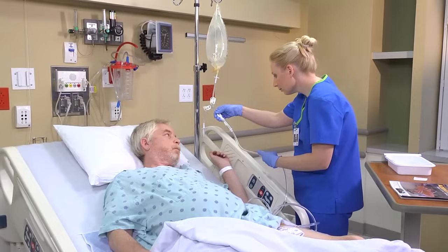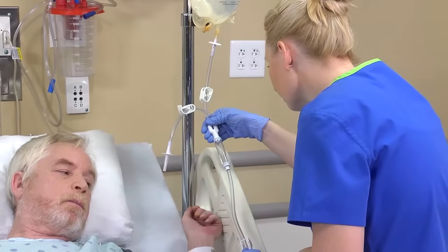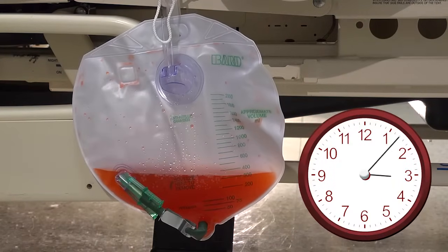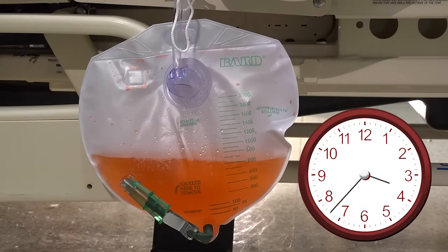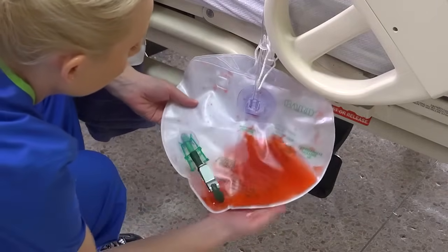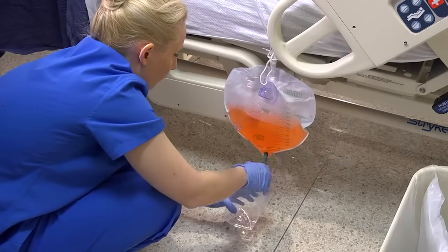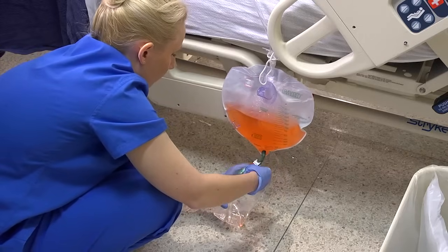Adjust the clamp on the irrigation tubing to start the flow of solution into the bladder. If the provider has specified the volume, calculate the drip rate and use the roller clamp to adjust it. If the urine is bright red or contains blood clots, increase the irrigation rate until the drainage turns pink. Follow the provider's order or your agency's protocol to determine the specific rate. Even if the urine is normal, keep an eye on the outflow of fluid and empty the drainage bag as needed. Goggles or other PPE may be worn when emptying the drainage bag.